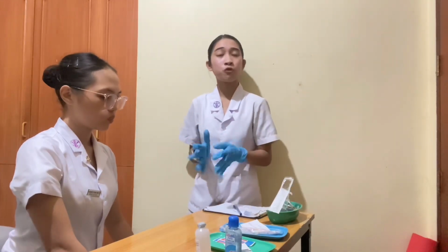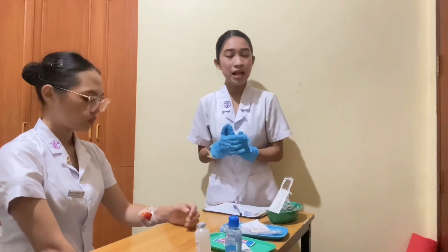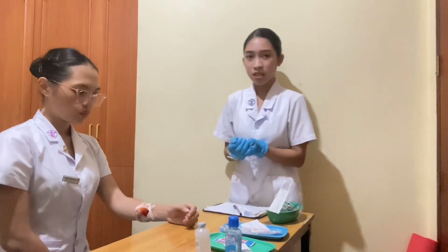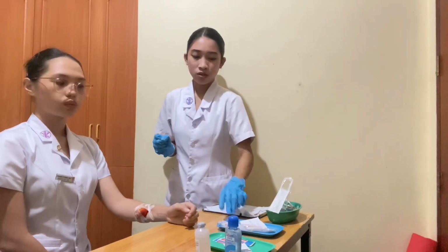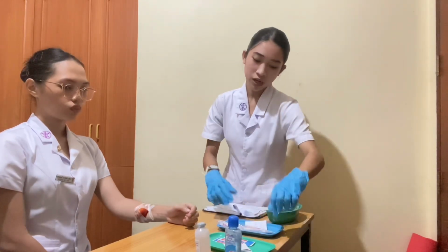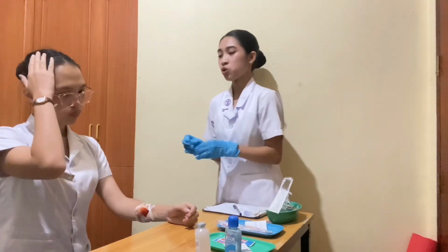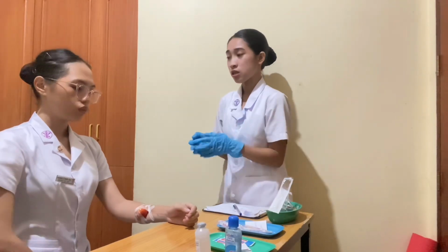Now I'm going to perform the intramuscular medication. After preparing the medication, I'm going to again head over to my patient, introduce myself, and explain why that medication is needed for her. Ma'am, Dr. Rivas has ordered vitamin K for intramuscular. This is a vitamin for you so that you will feel better for the next incoming days.